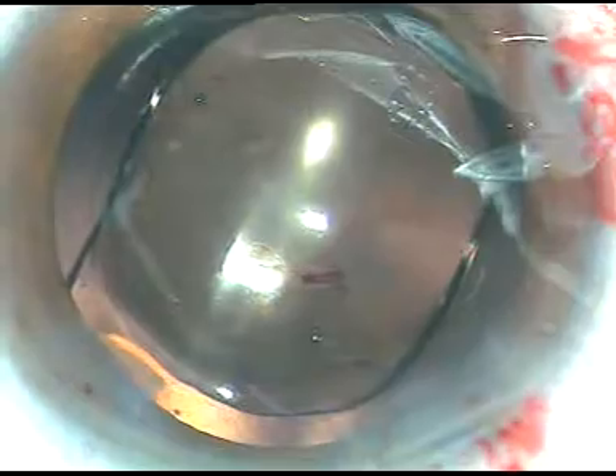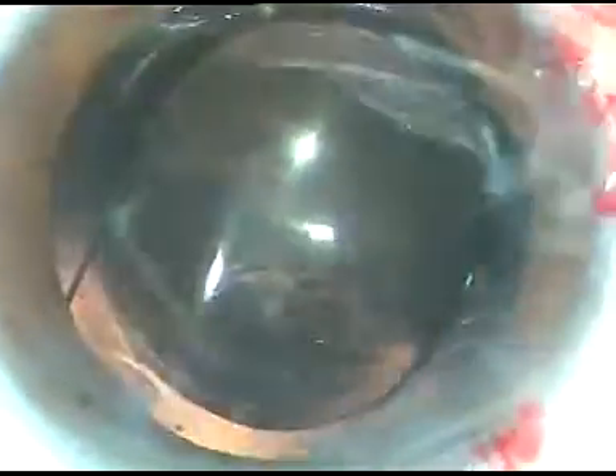Here it is. The incision has not been enlarged, and the tip of the cartridge goes inside the anterior chamber. The lens is being delivered in the capsular bag — the leading haptic has gone into the capsular bag, and the trailing haptic is dialed and sent to the equatorial region of the capsular bag. This lens takes longer time to unfold; it unfolds gently. It unfolds faster in viscoelastic substance; if I use only irrigating fluid, it unfolds more slowly.